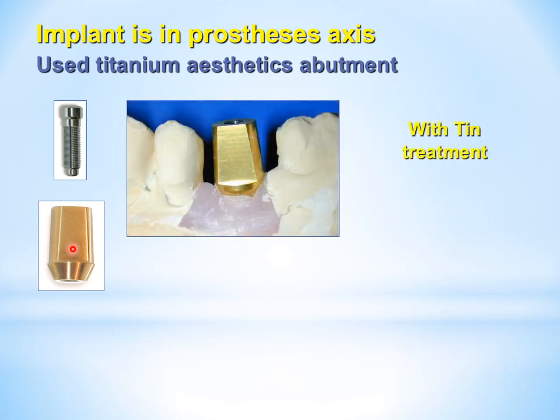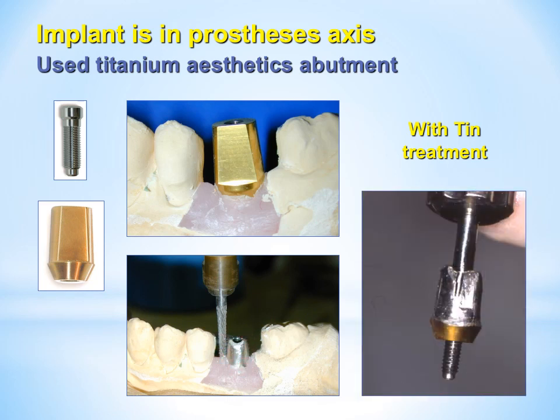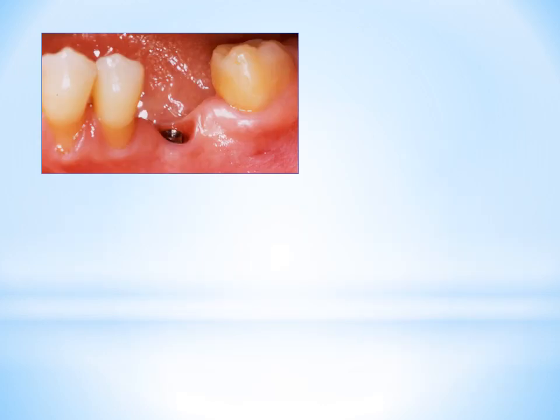This is a titanium aesthetic abutment fitted on the cast after removing the impression post, and then preparation of the abutment in the lab.